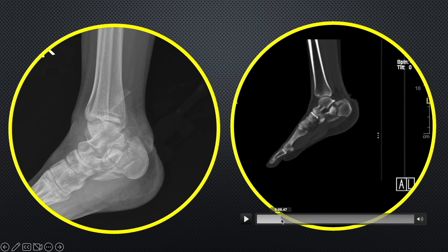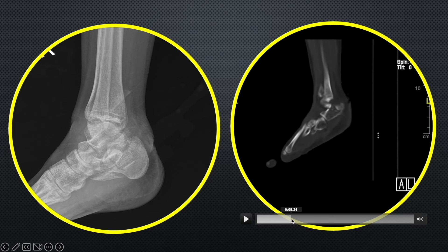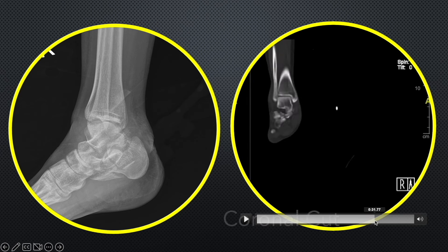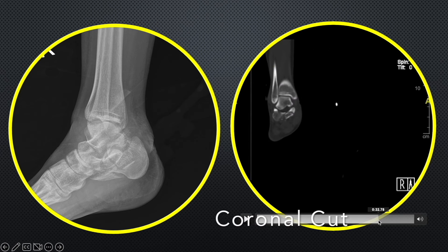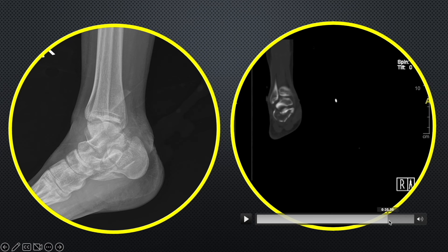As we go more lateral we start seeing this displaced articular fragment. Laterally we have a depressed fragment of the posterior facet that is tilted downwards — this part should have been articulating with the talus but it is not doing so. This part is mainly lying on the lateral side. This is the undersurface of the talus here. The medial part is still maintained, while on the lateral side we don't see the facet at all because it is depressed and we'll be seeing it in a more posterior cut.